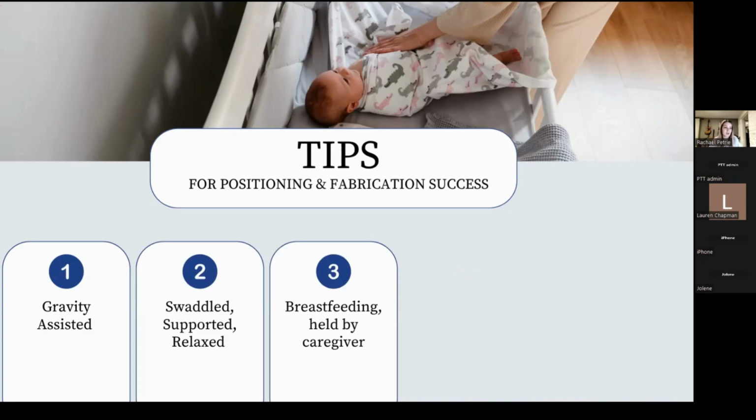Same for your older kiddos. You can get them distracted. You can have them play with a little piece of material in the other hand, have them make something on their baby doll or their teddy bear, that sort of thing. Whatever you need to do, some little fidgets, that sort of thing. But we really just need all of our patients calm and relaxed so that we can make the best splint possible.